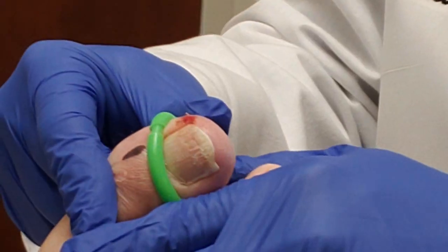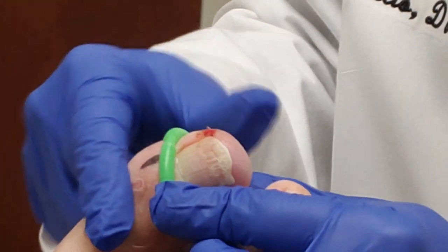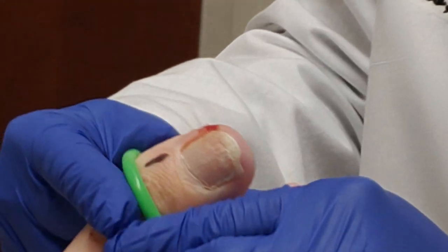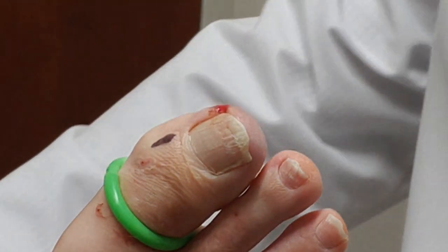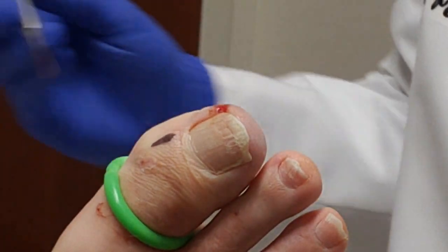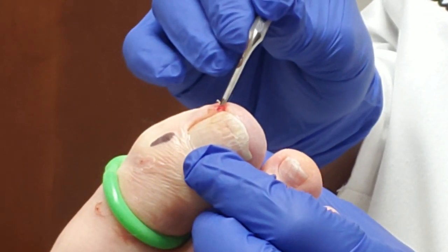What's that for? So this is something called a tourniquet. This is a little green thing that stops the blood flow. And for those that are watching, I'm with a patient and we have this little red thing right here.